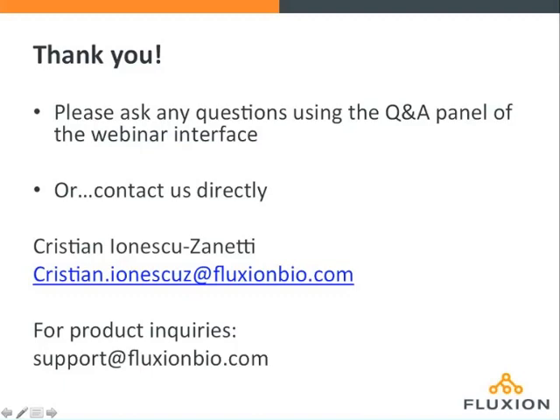There was another question about multiplex mutational testing, whether that's possible with the system. The answer is yes. I mean, as you saw in these studies, we looked at actually a panel of 7 KRAS and 1 BRAF mutation. I think using this approach, one can go to tens of different point mutations. If there's a desire to go above that and look at large panels of mutations, probably next-gen sequencing would be most appropriate for that type of work.